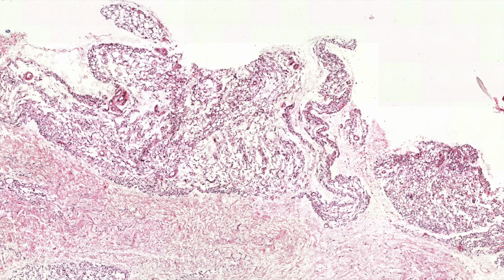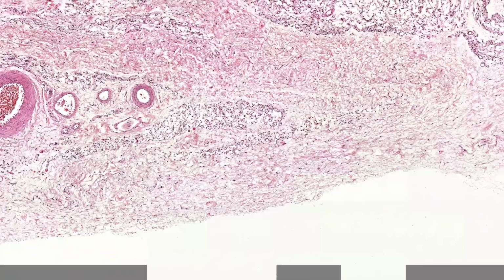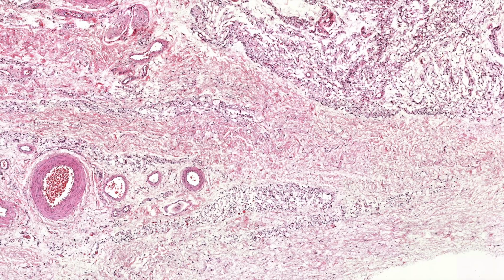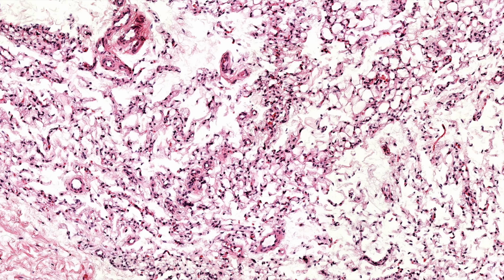It looks cellular, but you can still see that it's in lobules, right? There's one lobule, two lobules. Here's another lobule. So remember, normal subcutaneous fat, or fat anywhere, is arranged in lobules that have delicate fibrous septa in between and the bigger vessels in the septa. And then as you get out into the middle of the lobules, you have little tiny vessels. These little tiny vessels, look how many. There's tons of little tiny vessels.